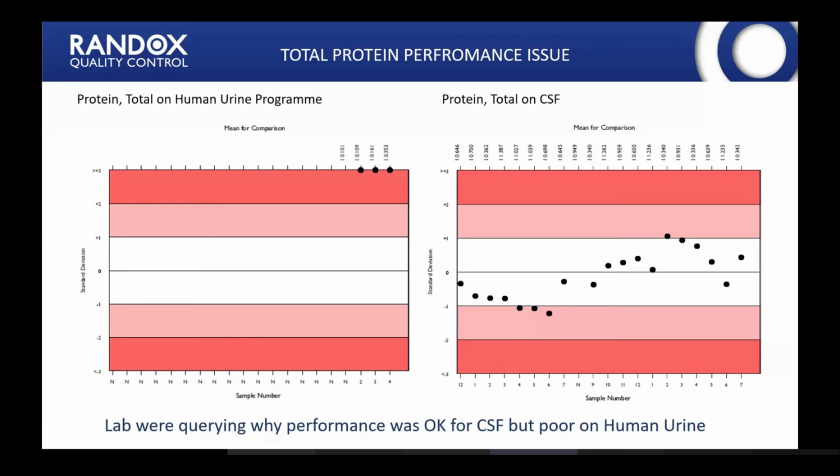Okay, here we have another situation that came about very recently, actually. This case was for total protein, and we had two different scenarios here. One is the total protein on our urine program, and then total protein on the CSF program. So the question was, it's the same parameter that they're measuring, so why do they have such different performance? Why was it okay for CSF, but poor for the urine program?